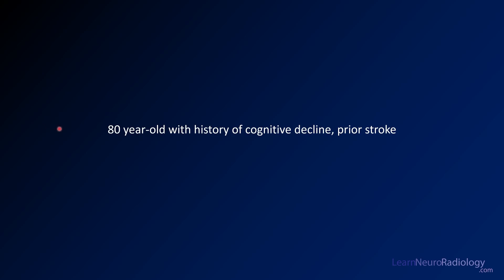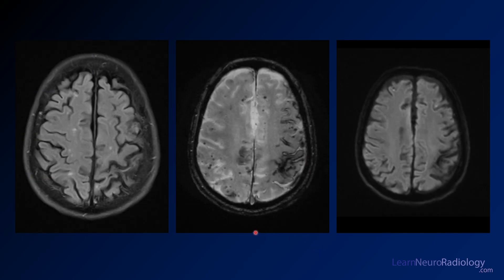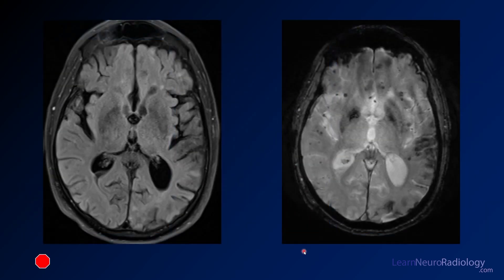We'll start with a case of an 80-year-old with a history of cognitive decline and prior stroke. Here you see some images through the brain from an MRI. We have a FLAIR, a gradient or susceptibility-sensitive sequence, and in this case, diffusion. What you'll note on the susceptibility sequence is a number of small areas of susceptibility around the periphery of the brain parenchyma. You'll also see along the surface of the sulci some low signal along the surface of the brain, along the gyri, and down into the sulci. That's what we would call siderosis or superficial siderosis. Going to a different level, you just see more of the same — more scattered peripheral hemorrhages and more superficial siderosis.